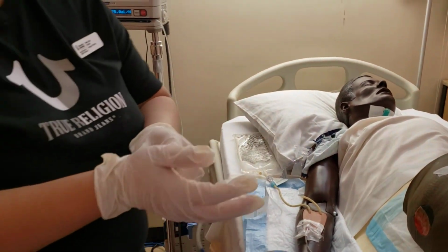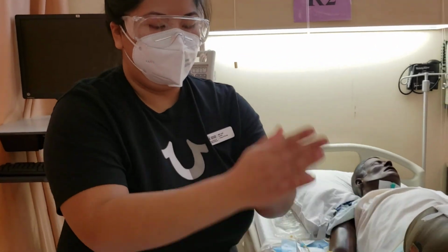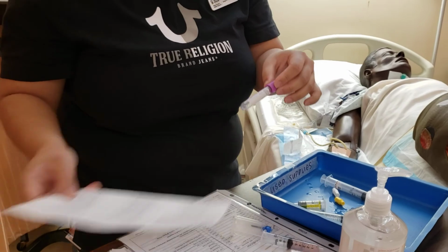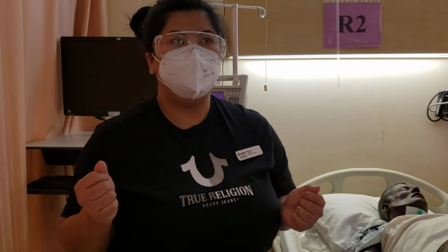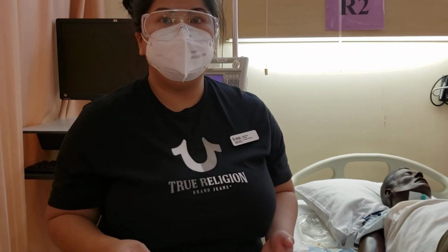And then I would do hand hygiene, and then I would label my blood tube, and then send that to the lab along with my requisition. And I would sign my MAR for the heparin lock, as well as fill in the CVAD flow sheet.